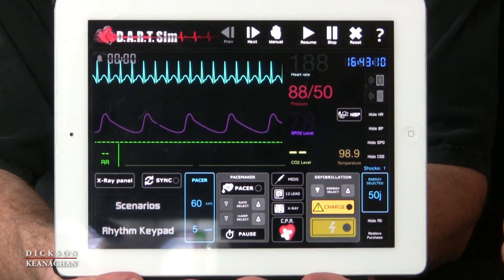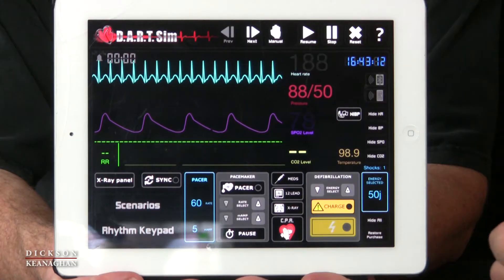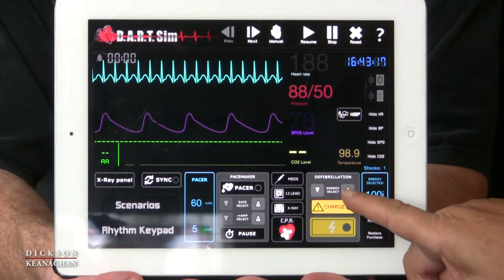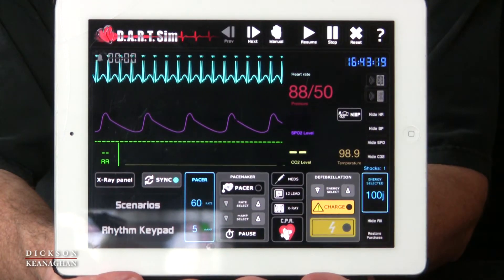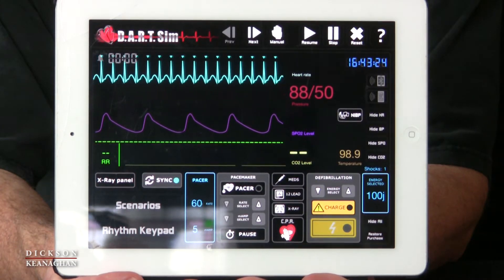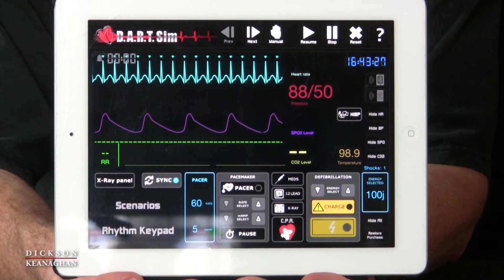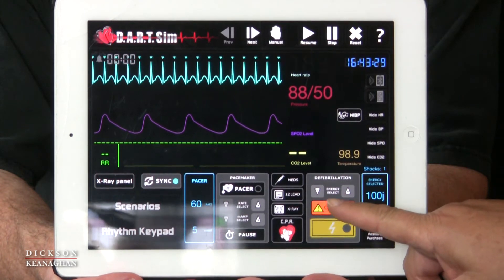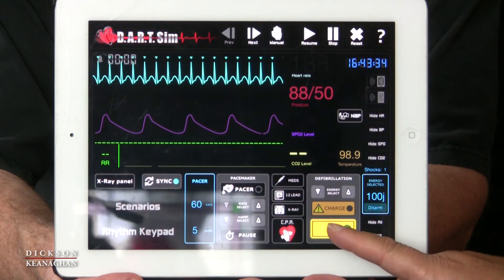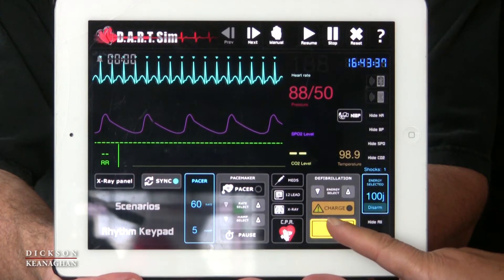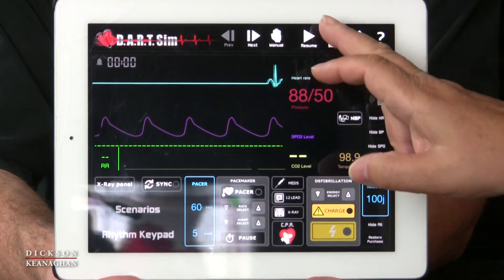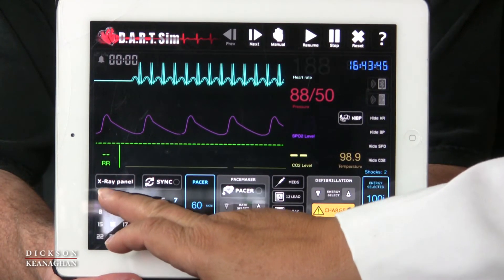If that's infusing and there's no change, I'm going to have to get ready for synchronized cardioversion. I'm going to go up to 100 joules. I have to remember to press the sync button again. If the patient is stable, I might wait and see if the amiodarone will work — it doesn't work as fast as adenosine does. But if we have to, we will charge it up, consider sedating the patient. I'm clear, oxygen flow is clear, everyone clear. Shock delivered. Hopefully the patient will go back into a regular rhythm.